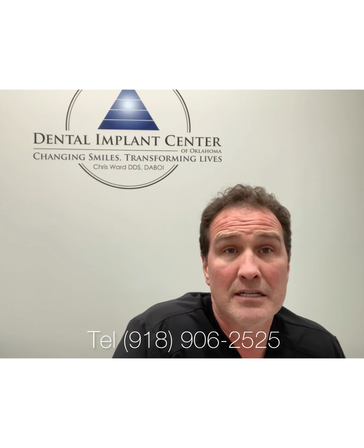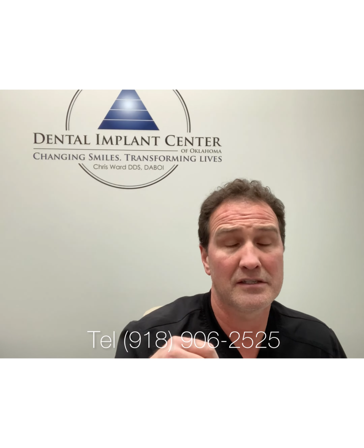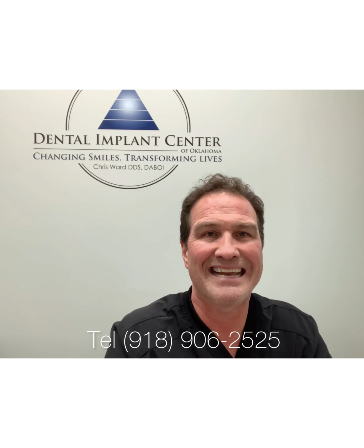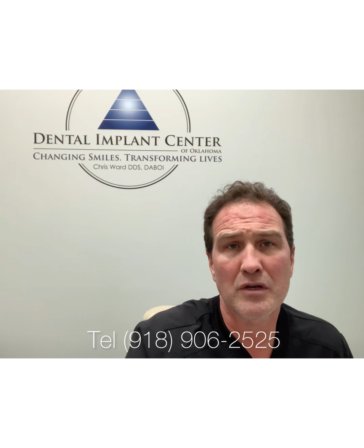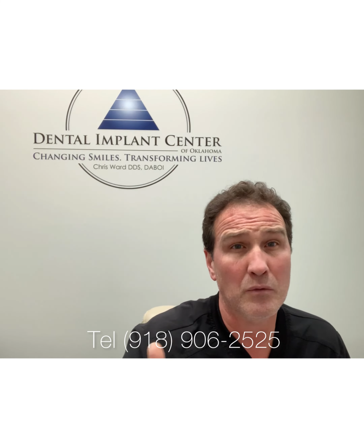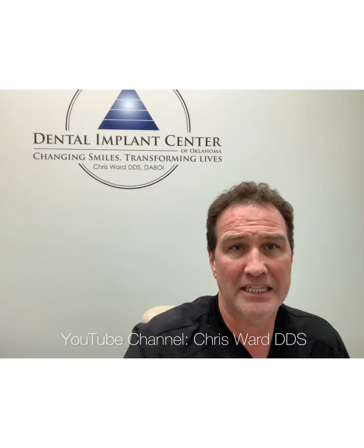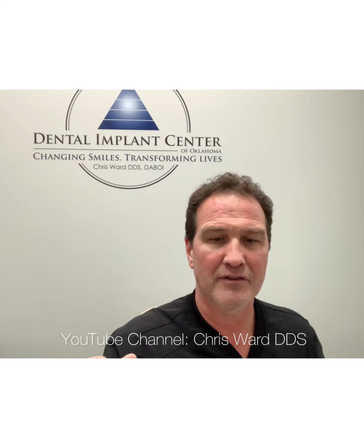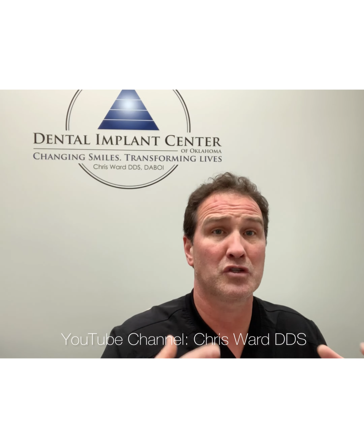The most common is an endosseous implant. Those implants are cylindrical. They have exterior screws, channels, so that when you put it into the bone, it gives it what we call primary stability or some fixation to the bone so that it's solid the day that it's placed. What happens over time is the bone is broken down as part of the bone metabolic process, where it gets soft for about the period of 4 to 8 weeks is when it's the softest after surgery. And then the bone begins to mineralize and get hard and change from osteoid, which is a softer material, to bone again. Once that happens, now you have where the bone is physically grown to it, it's solid, and you can start loading, or it can handle mechanical stresses.